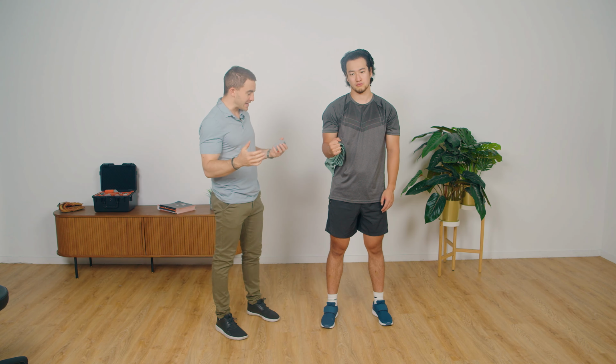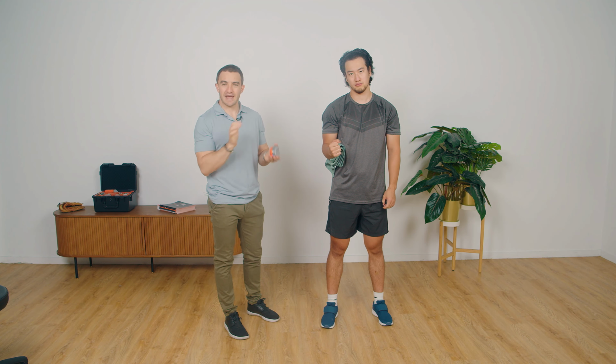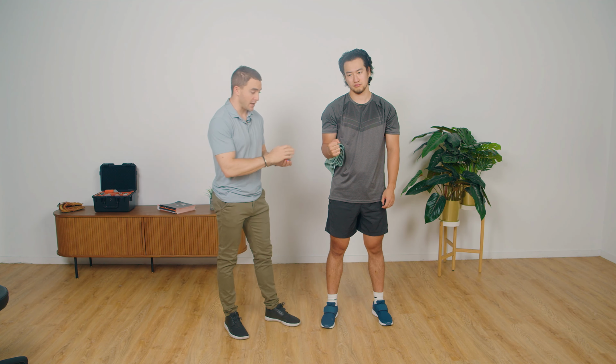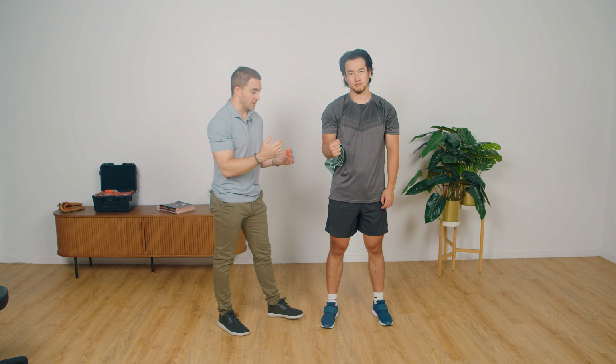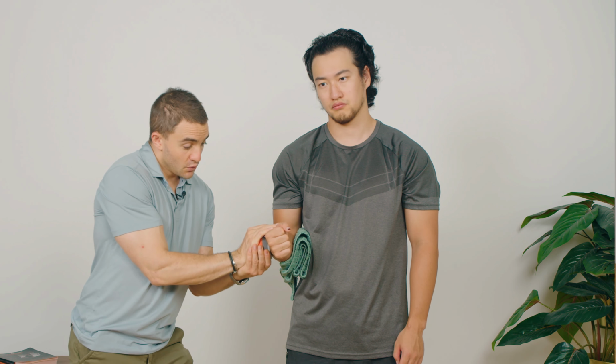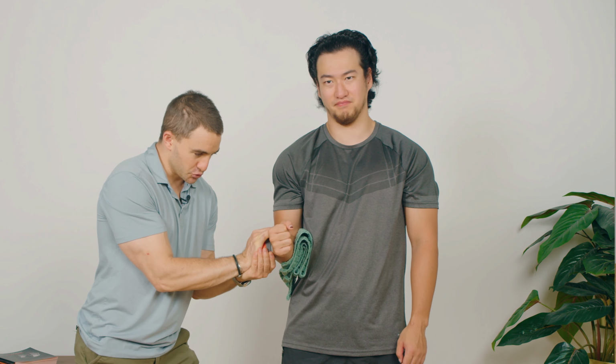And what we want to do is measure as best we can the intent to purely externally rotate. So a make test, as I learned it, is for a patient to make as much force as they can into a fixed object. So my cue to Cal here, now it's important that I brace well. We can also do this against a fixed object, but this is the way that I would do it. I'd say, Cal, when I say go, push into me as hard as you can. 3, 2, 1, go, push, push, push.